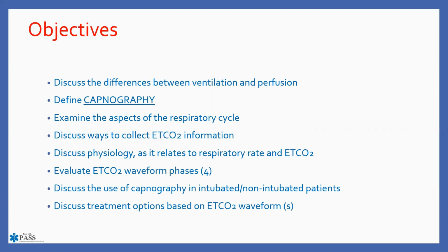We'll also discuss the use of capnography in intubated and non-intubated patients. So, you know, we always look at this as a Class 1 recommendation and a medical legal aspect for your intubated patients. But what about those individuals in a non-intubated situation? So patients that are suffering from an exacerbation of COPD, maybe it's a pulmonary embolus. So other things that we may be able to look for on capnography, even in a non-intubated patient. And then finally, we're going to discuss treatment options based on end-tidal CO2 waveform.